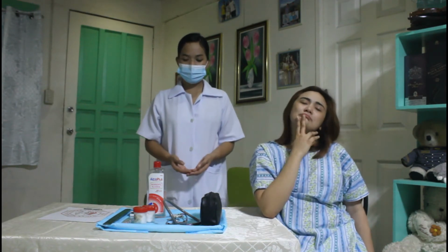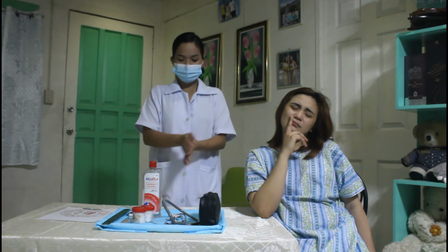So before we perform our procedure, we perform hand hygiene first. This will prevent transmission of microorganisms. So I have here an alcohol. And then next, we identify our patient. This will ensure the correct patient.